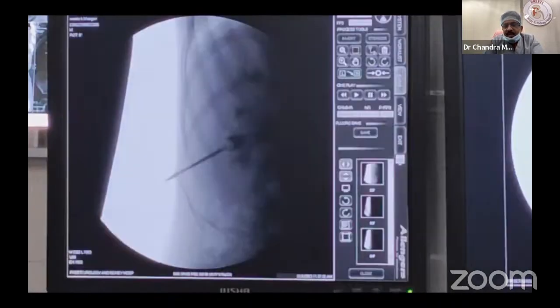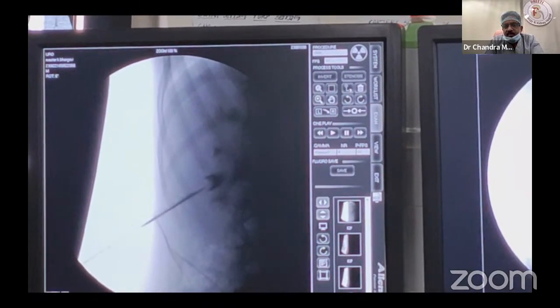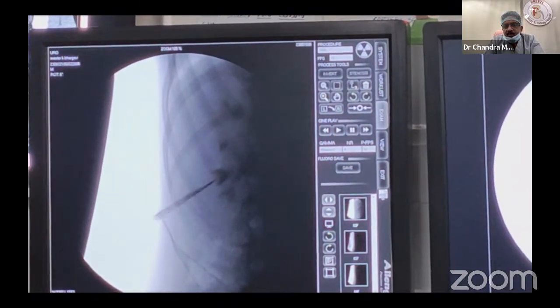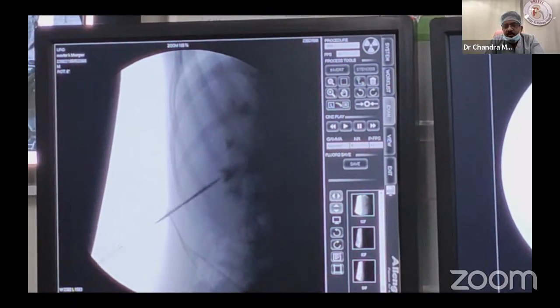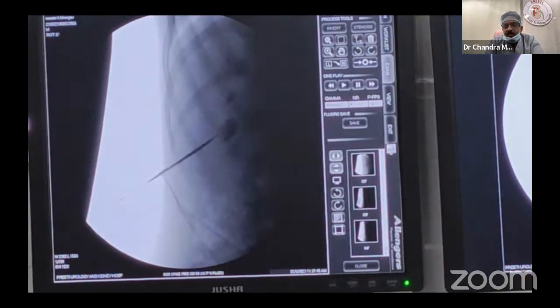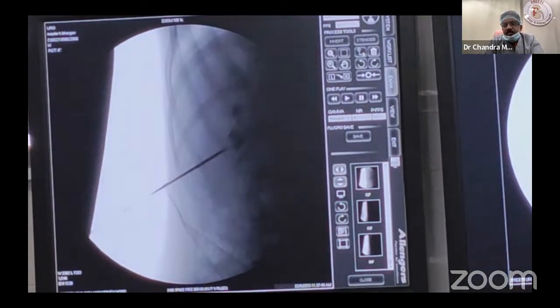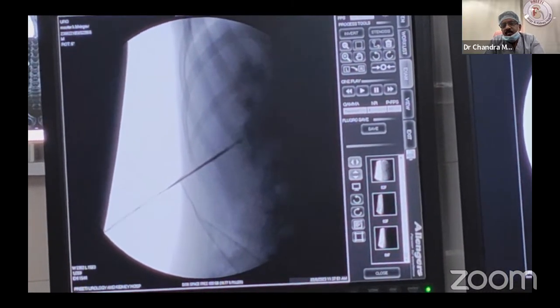Now I will check whether it is moving or not, posterior, anterior. A little bit of adjustment I am doing. When it moves maximum, it is not moving maximum. See, now it is moving maximum. Can you see that? Inject contrast, Ramakrishna. Can you see that?